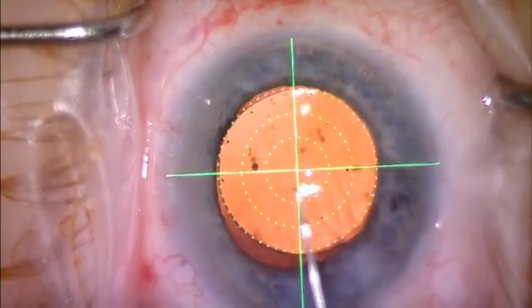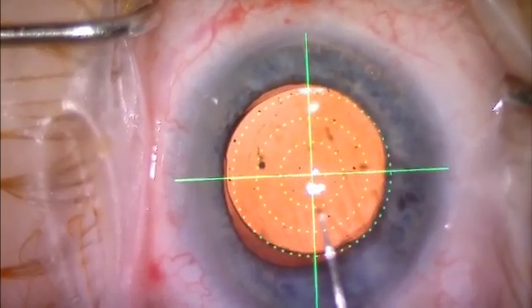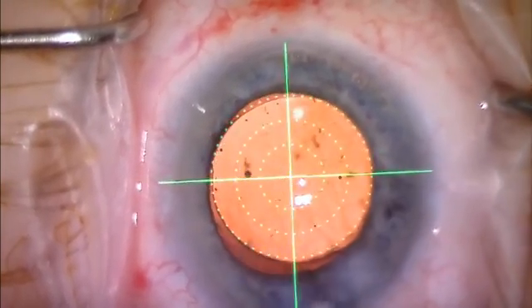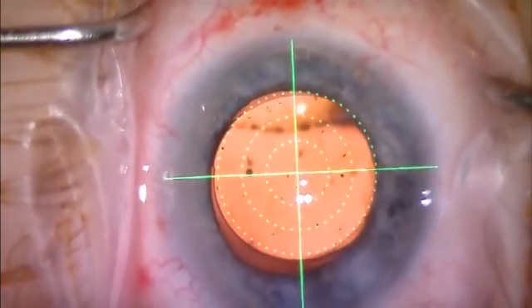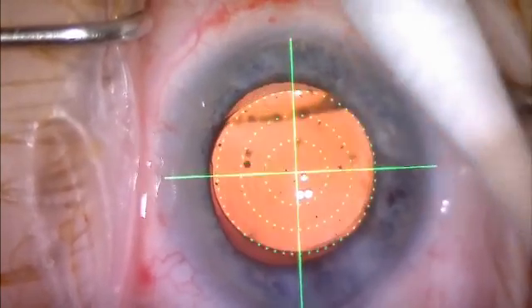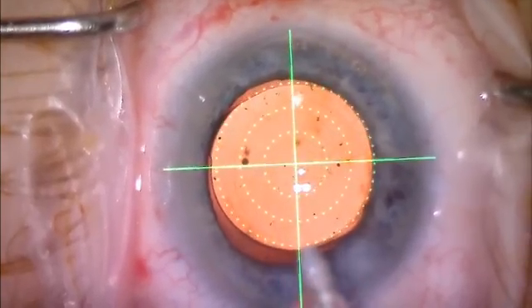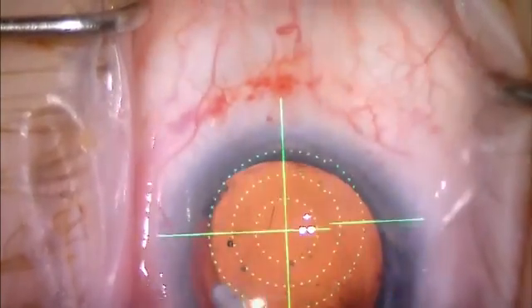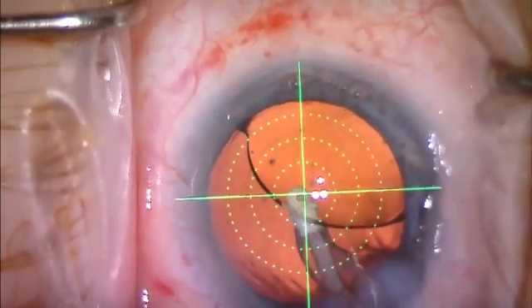As you can see here, we can even set it on the intraoperative pupil or the limbus as well. So once we start, you can see how that moved just very slightly. In some patients, obviously, it moves a lot more. Sponge, please. It will move a whole lot more, but here the visual axis and the pupil center, pre-op pupil, were very similar.